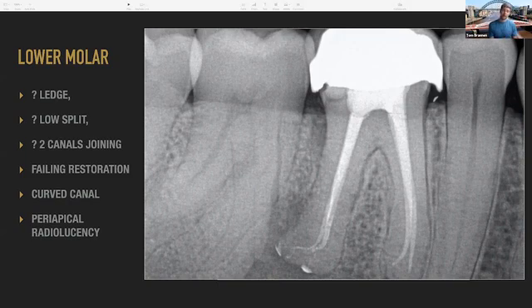So as well as getting the GP out, you've got to get these wedged in plastic carriers out along the whole length. And it's similar to taking a file out, you've got to try and loosen it. But because it's plastic, it doesn't vibrate. You can't send ultrasonics through it like you can with a file. So it's more of a pain to get out.